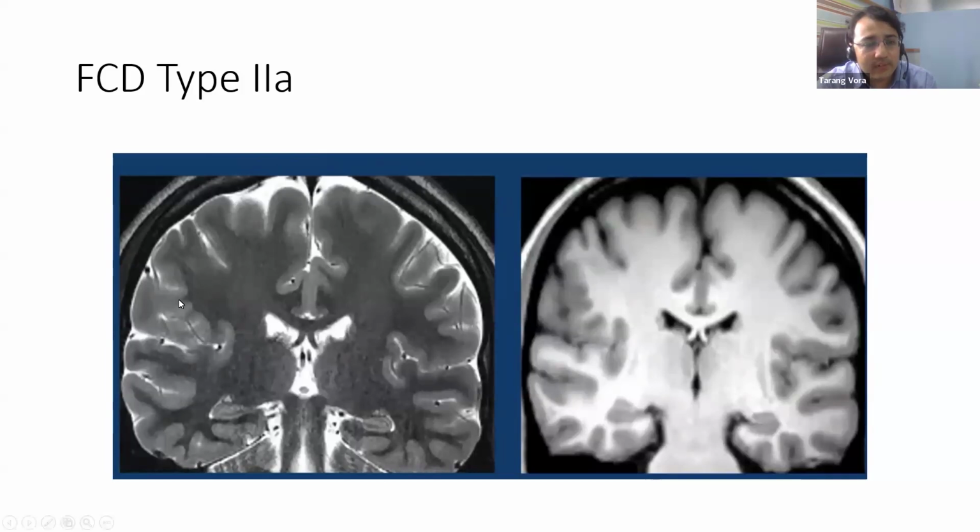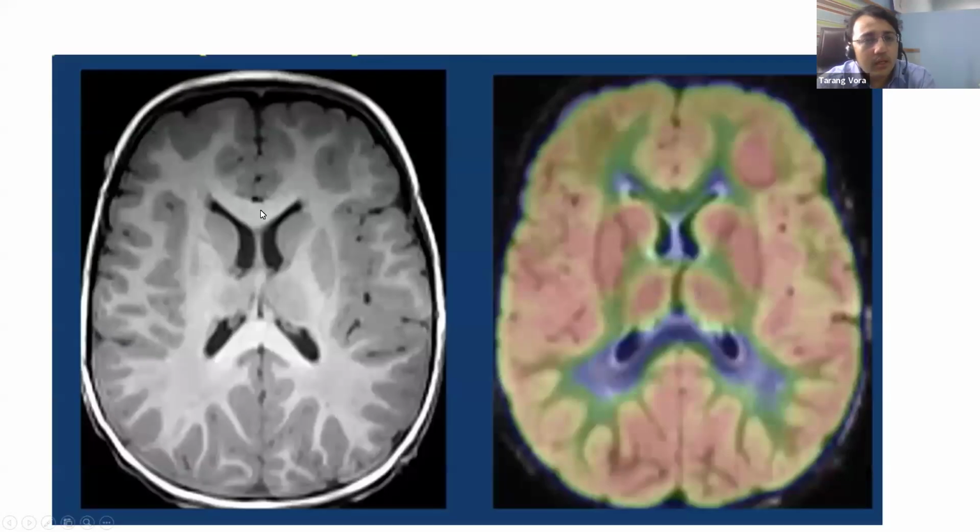You will understand it on gross examination. The MRI looks pretty normal, and it's not like you will see a tumor or something. But if you're looking over here, I don't know if my arrow is visible on the sharing screen or not, but there is a lot of gray matter over here, and there is not an equivalent amount of gray matter on the contralateral side, and this is what is FCD type 2B over here. 2A, sorry.